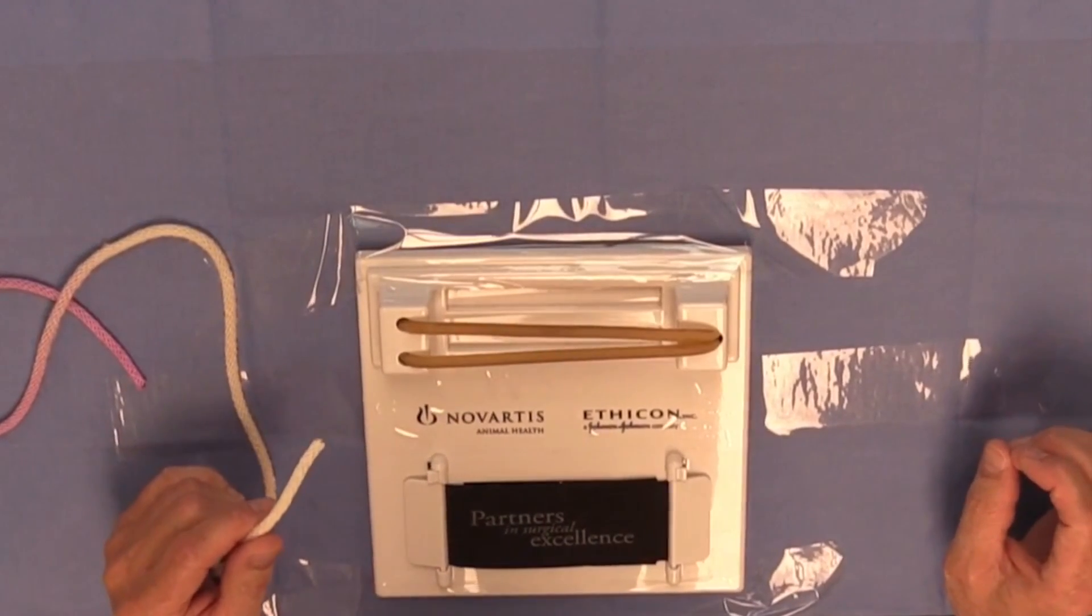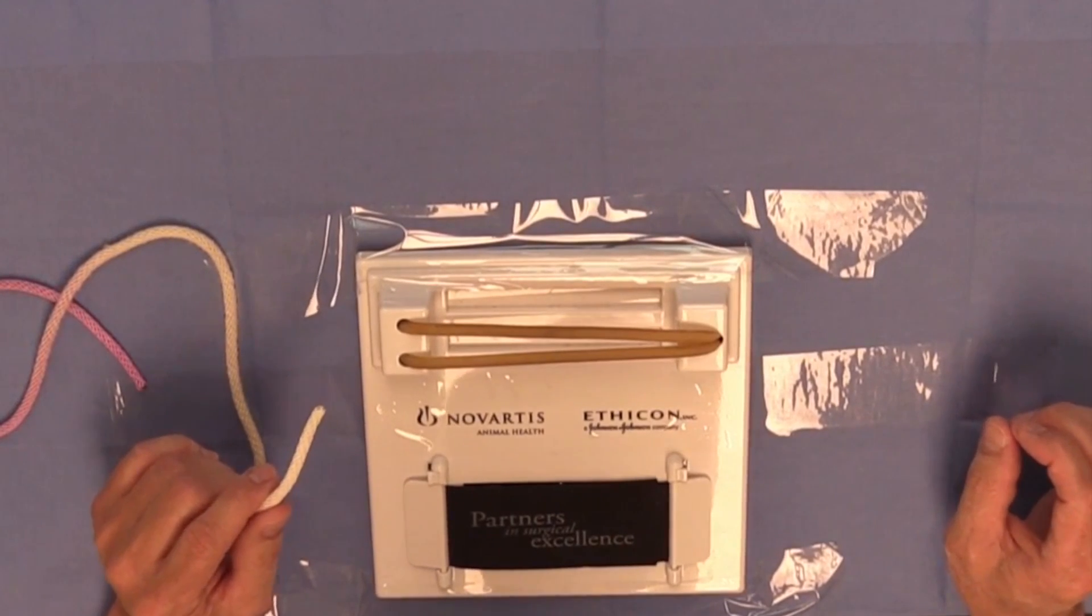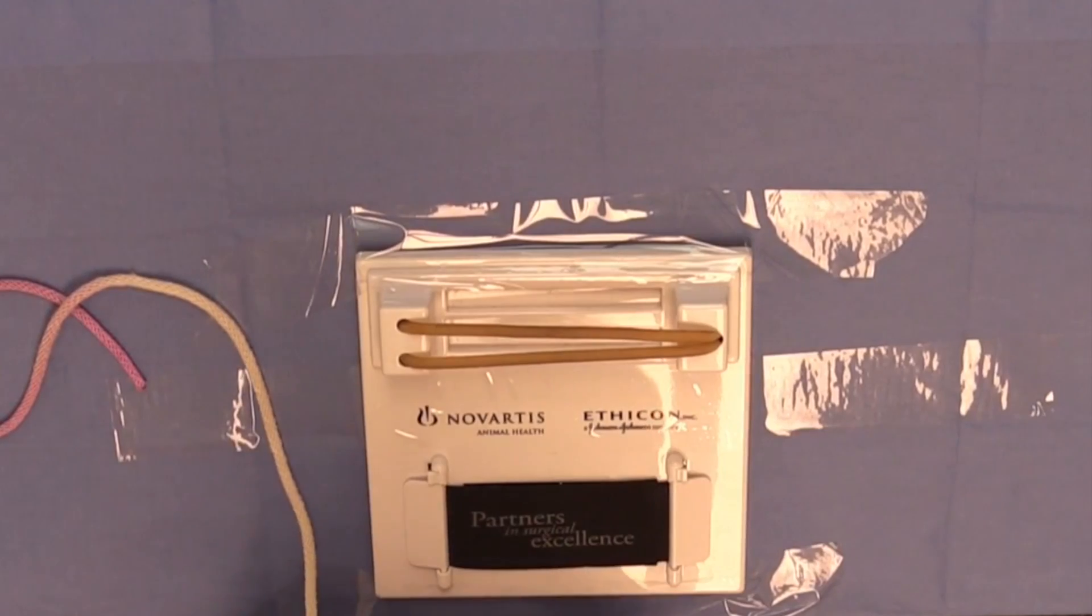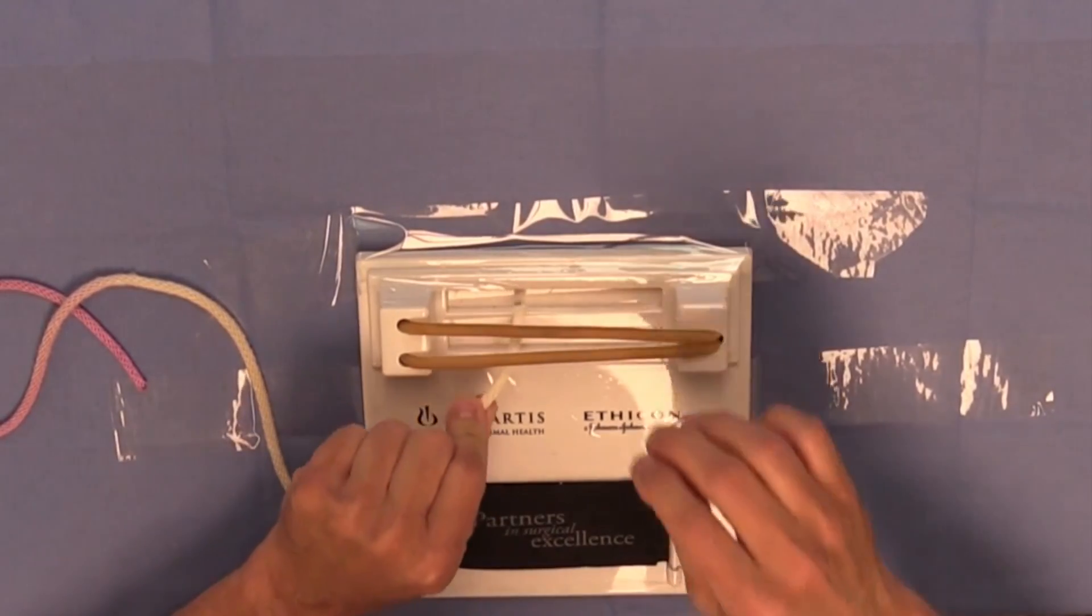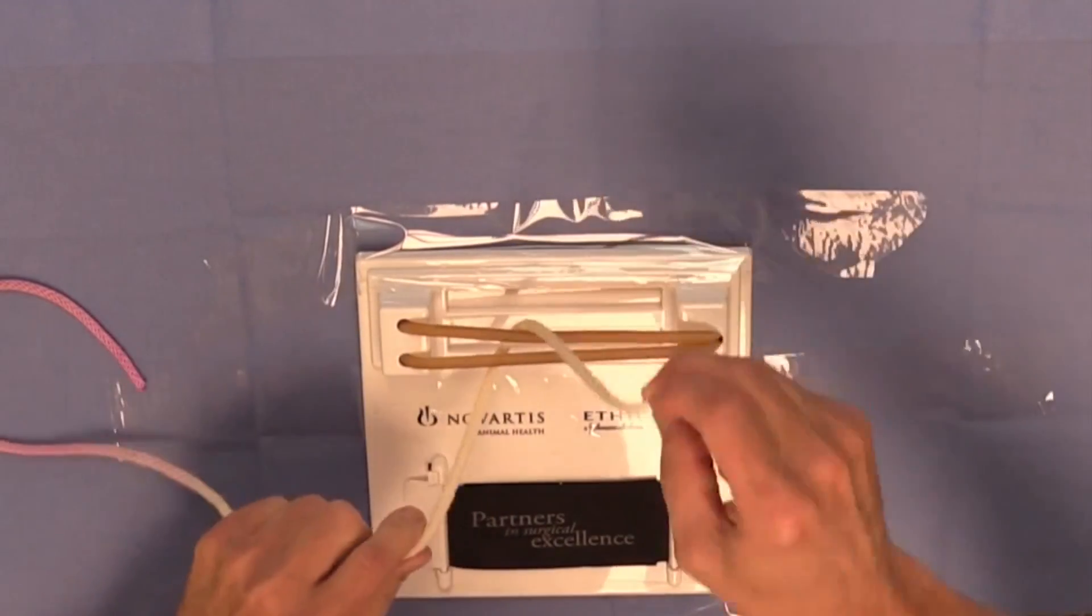There is a second way to construct a surgeon's knot using a one-hand technique that might be a bit simpler than the previous one that I demonstrated. This time, I'm going to feed the suture material around the tubing underneath and around and toward me, such as this.